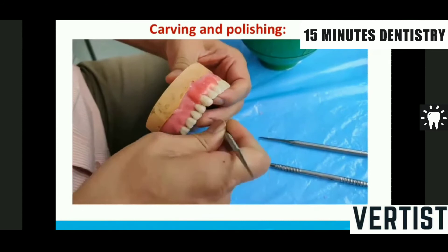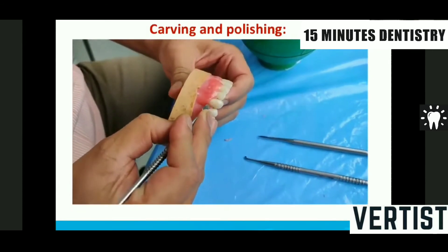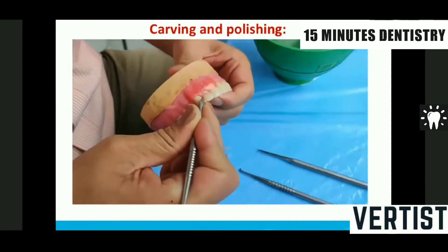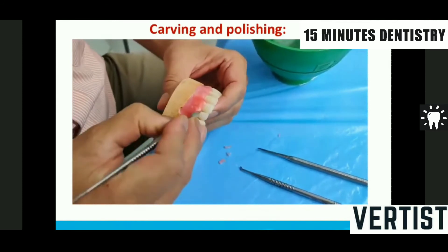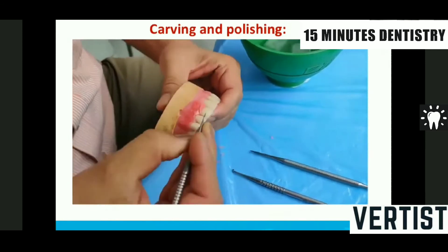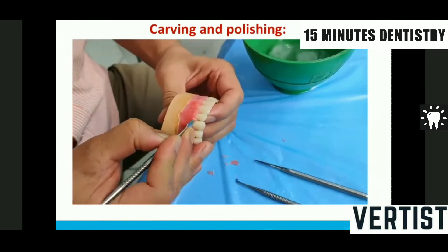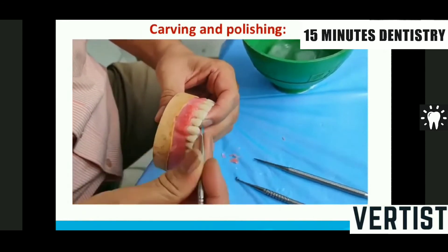First, you start removing the excess wax. After waxing up, you remove the wax and expose the cervical line. All the teeth have a cervical line, and you have to expose down to that line — only then will the aesthetics of the complete denture be seen. Look at the direction I am holding the instrument and slightly bevel the margin so you don't have a thick rollover of wax.